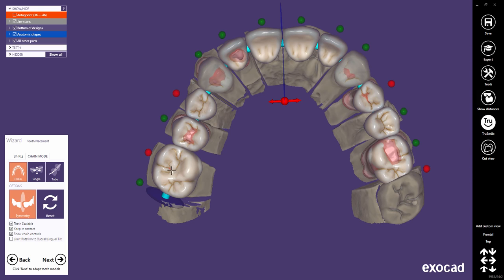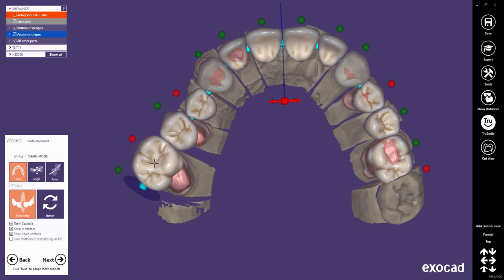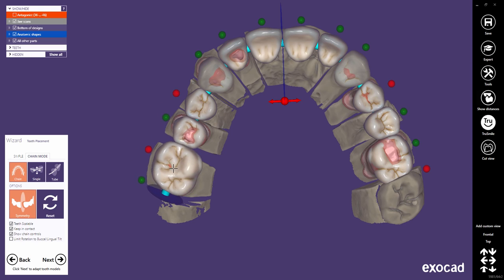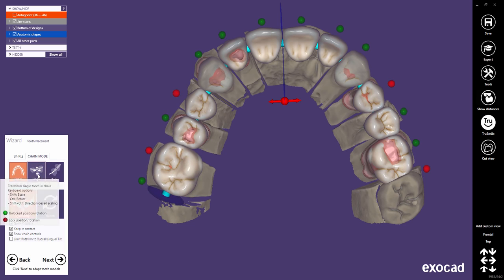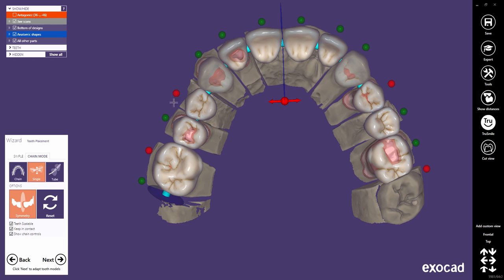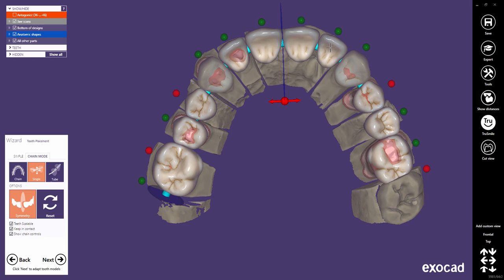In front symmetry, transformations for the posteriors will not be mirrored to the other side. With the plane in single mode, you now have a perfect configuration to do some fine tweaking on the anteriors.